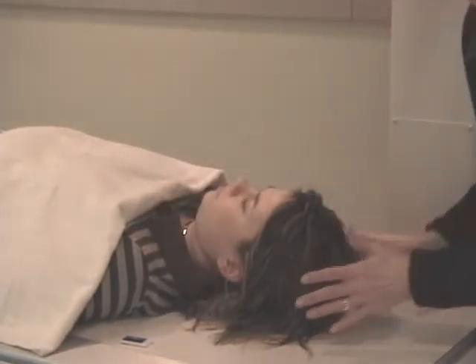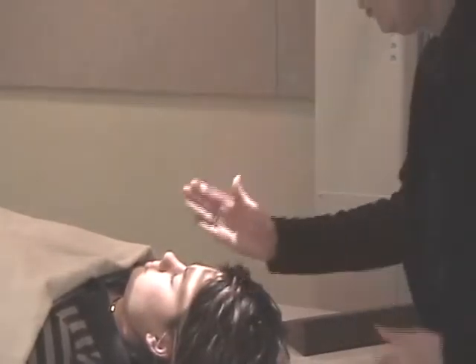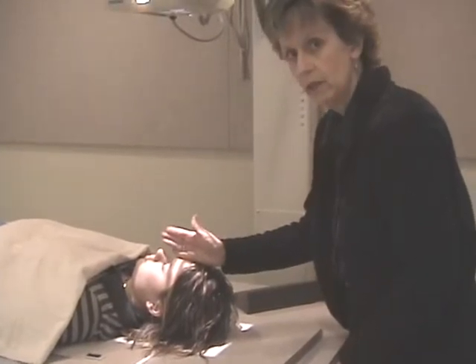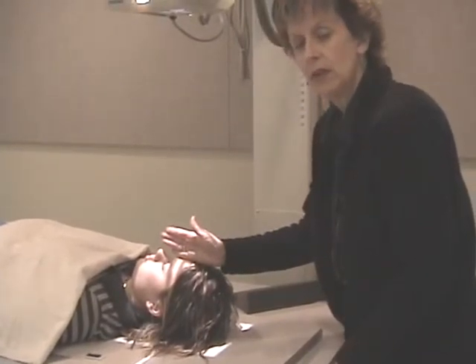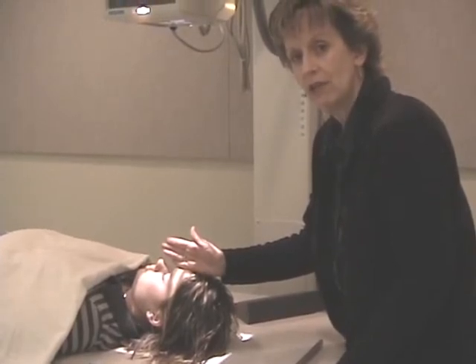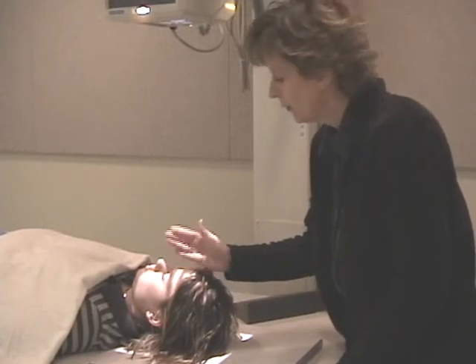Then I positioned myself at the head of the table like I am now, and I made sure that the crosshair was coming down the center of the mid-sagittal plane. And then I looked at the distance from the outer canthus of her eye to the lateral aspect of the skull to make sure that distance was equal on both sides to verify that the MSP was indeed perpendicular.